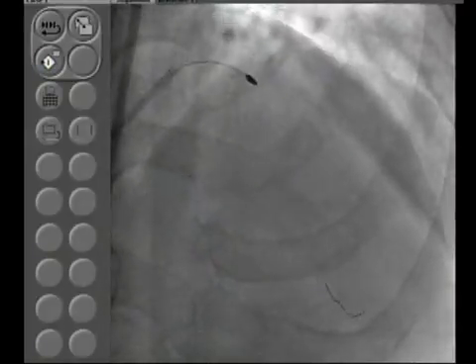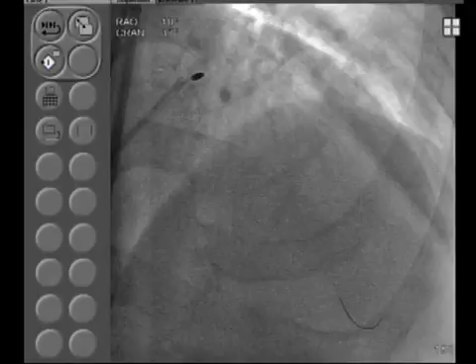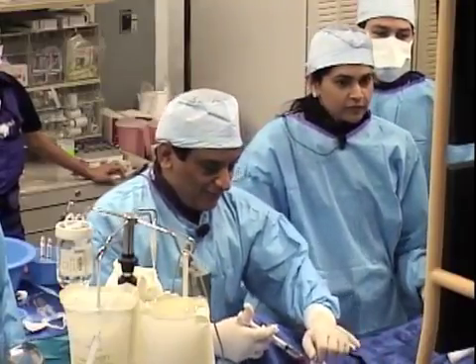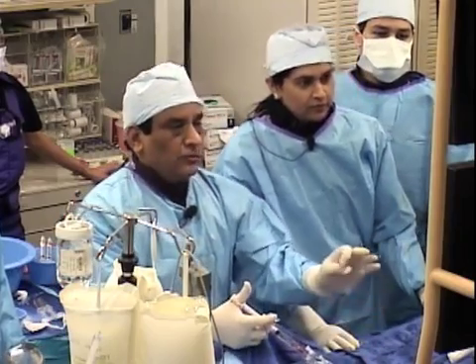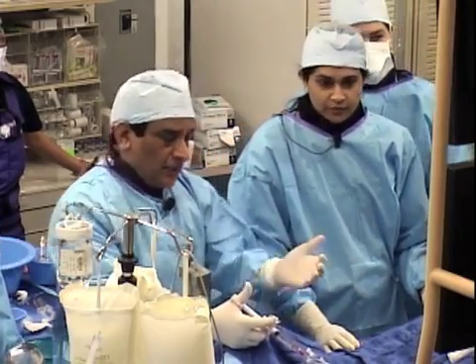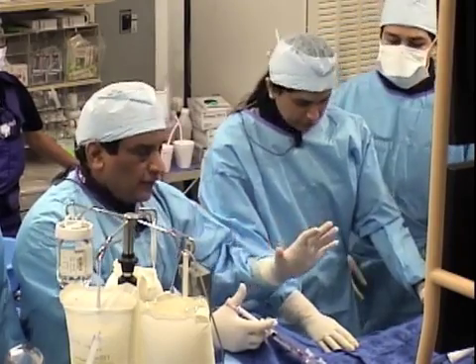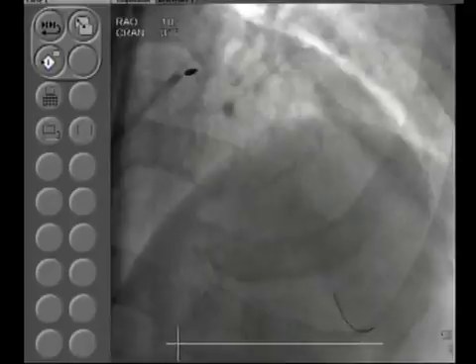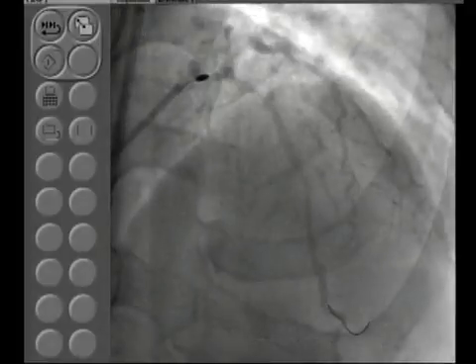Hold back and wait. Yeah. This is, well, 2.0. Always the issue comes. Now sometimes also, when you see that things are not making sense, pull back the burr, give it a little room and then take a picture. It will tell you where you are. Now I think things are okay here, we need to go the last few millimeters. The rest has been done reasonably well.